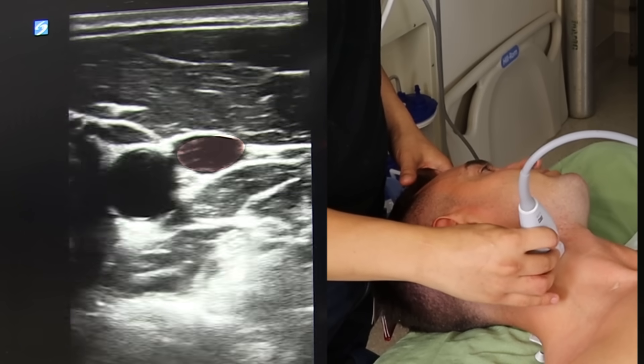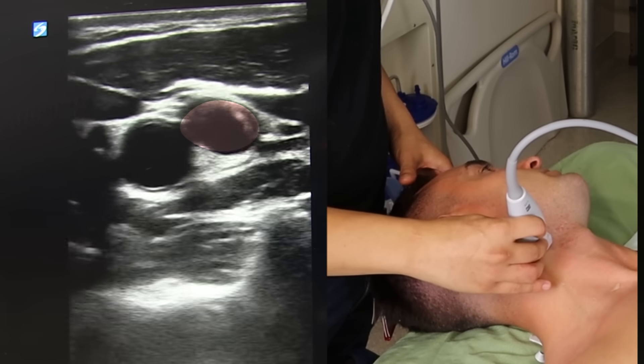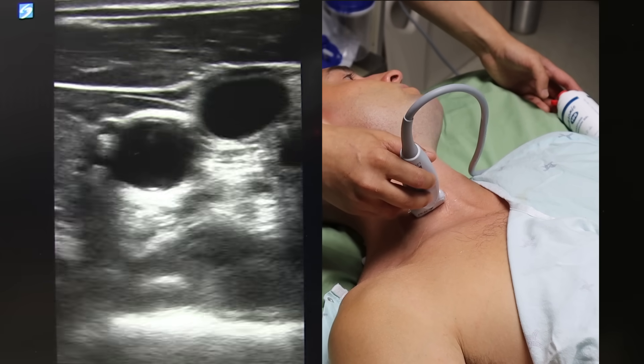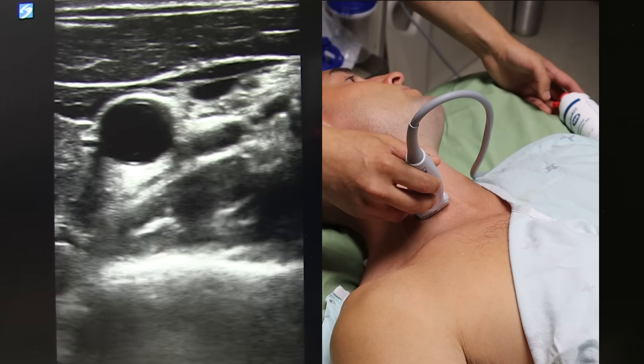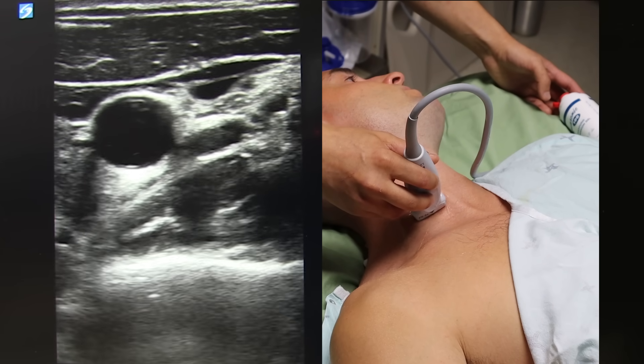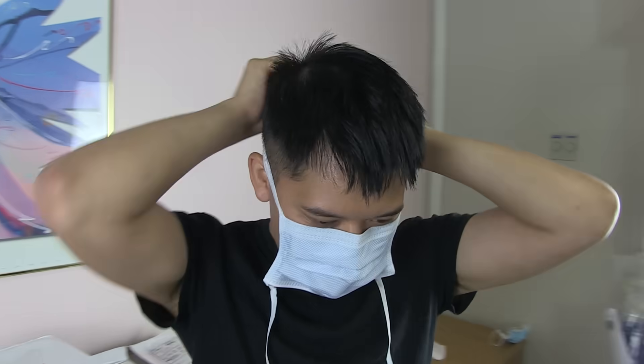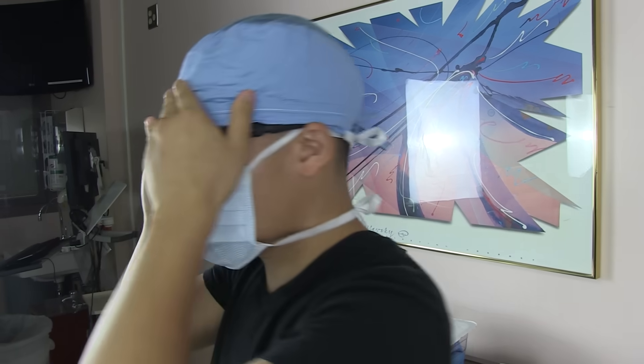I know this is the internal jugular because it is lateral and superficial to that other vessel, which must be the carotid. You can convince yourself further by doing some compression testing. The vein will compress and the artery will remain plump and pulsatile. With that out of the way, let's grab some PPE and get the supplies we need for the procedure.